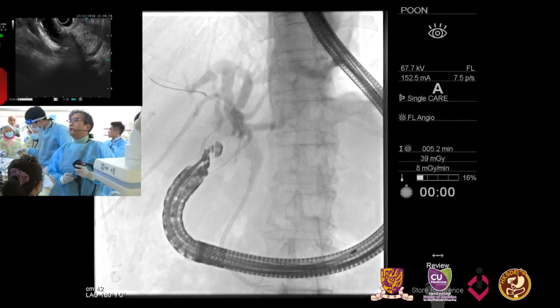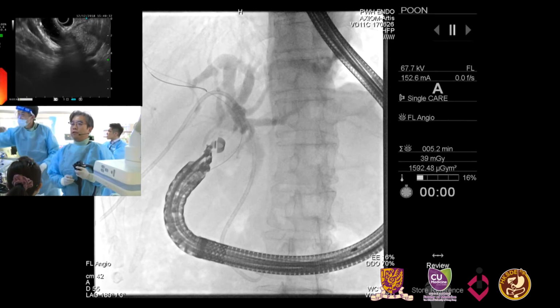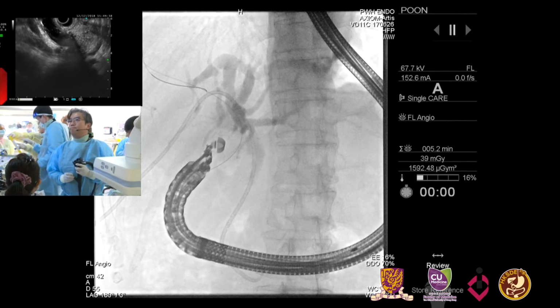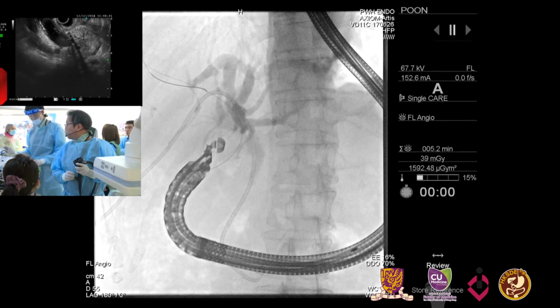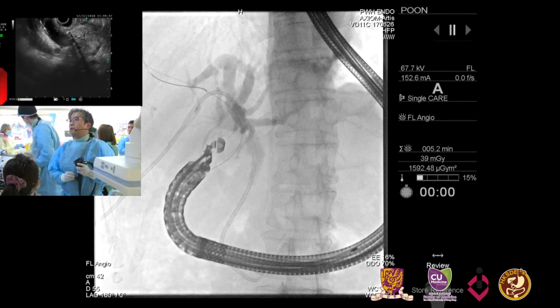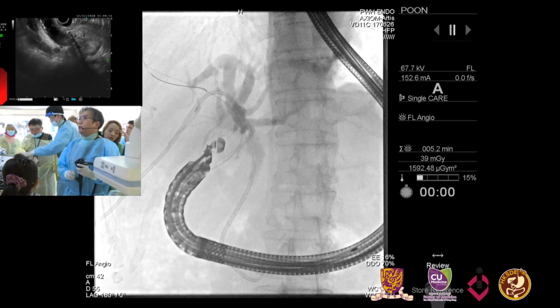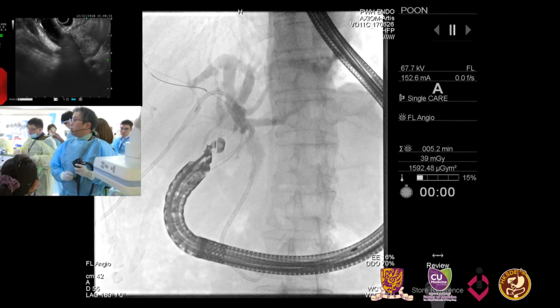This patient also received antibiotics prior to the procedure. Yeah, I usually give antibiotics before the procedure. The main thing you always worry about is biliary leakage and peritonitis. And then obviously stent deployment or perforation. The risk isn't that high, right? Because it's so short.